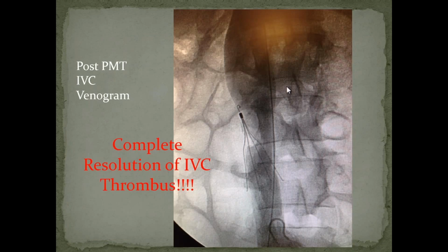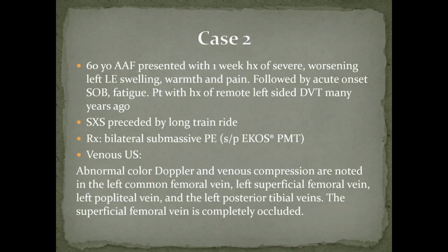In addition to this, if you look at the IVC venogram, which we showed was absolutely full with clot, after 1 day of EKOS thrombolysis, you have complete resolution of the IVC thrombus. This is an unbelievable result. The patient's legs decompressed within 24 to 48 hours, and he's done fine since.